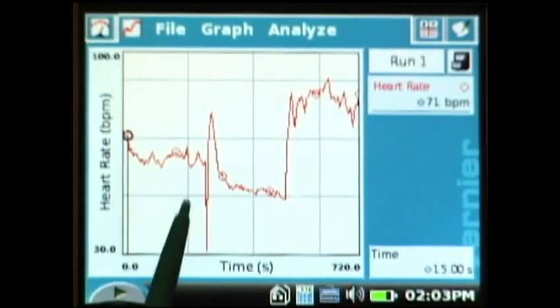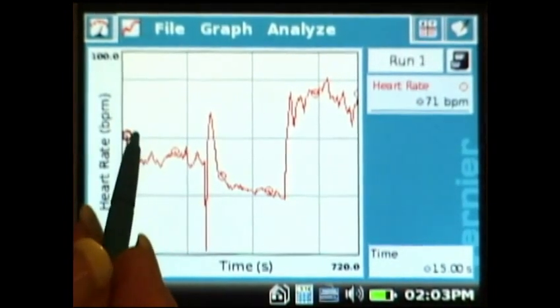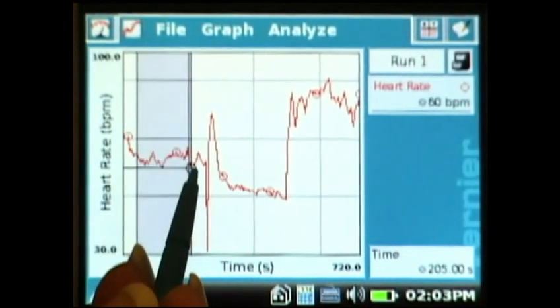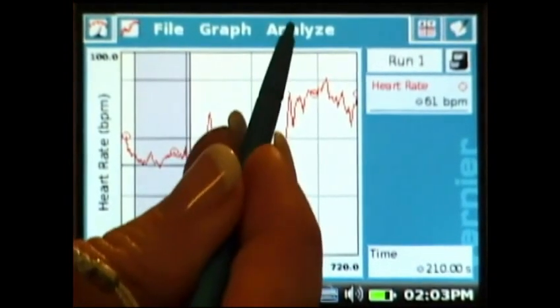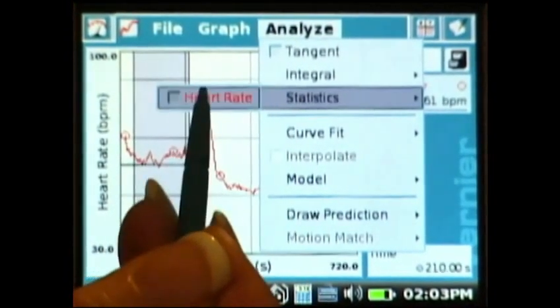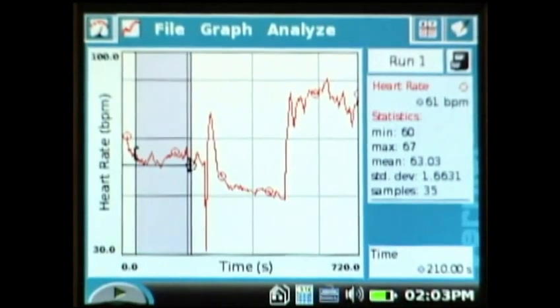We can actually look at the average heart rate for each of these three and you would do that one at a time. Take your stylus and select a region where he was sitting in the chair. Under analyze choose statistics for heart rate and you see that the mean heart rate is 63 beats per minute for that first section in the chair.